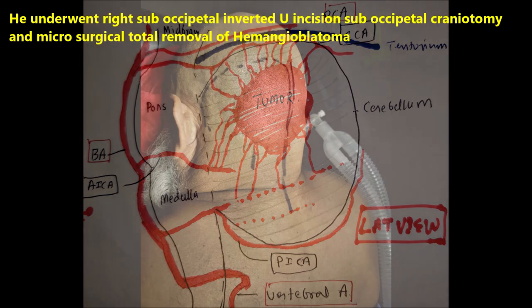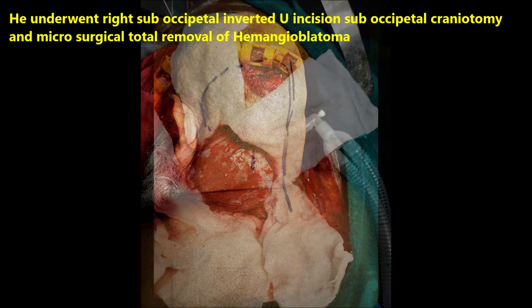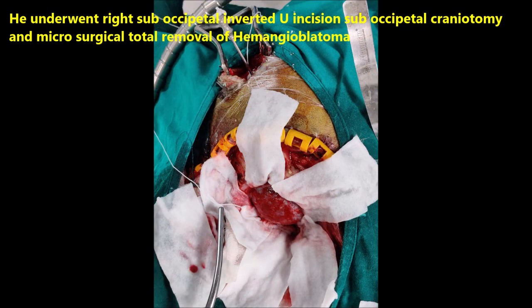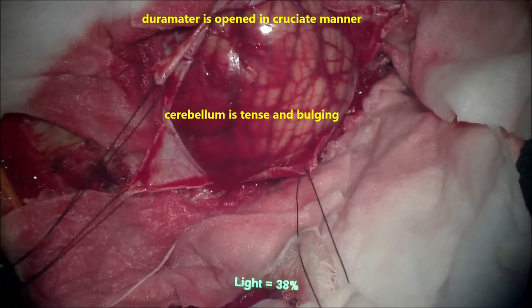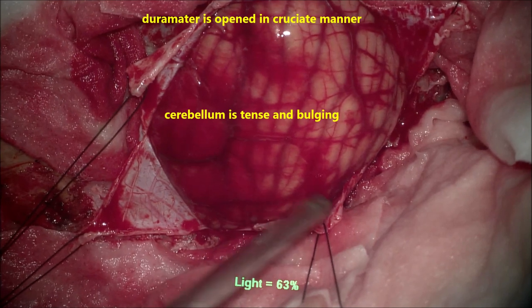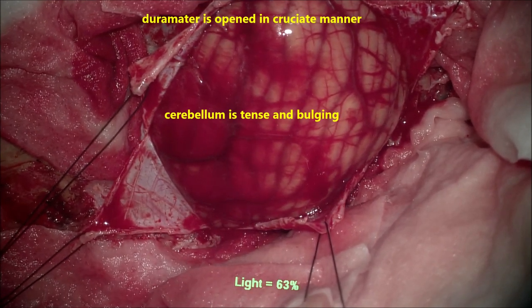He was taken up for surgery and underwent right paramedian suboccipital craniotomy with an inverted U incision and microsurgical total removal of the hemangioblastoma. These are the craniotomy steps. Once we open the dura in a cruciate manner, the cerebellum is very tense and non-pulsatile, probably due to swelling from the tumor.